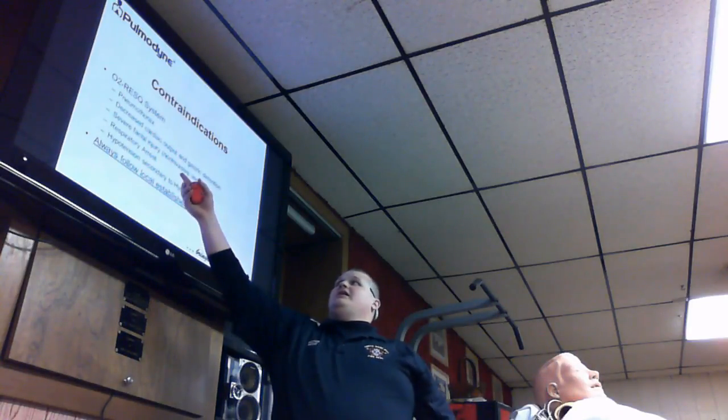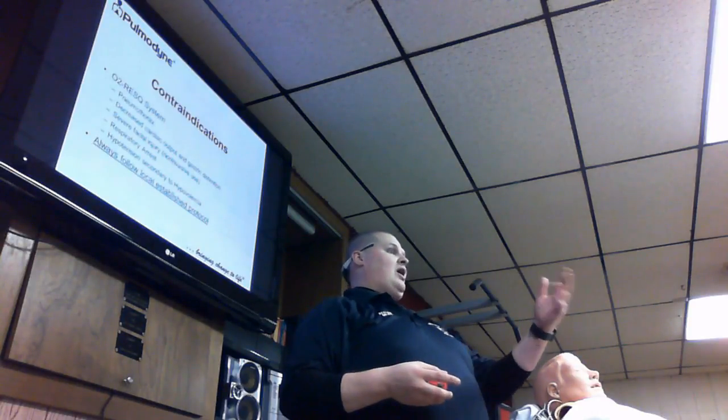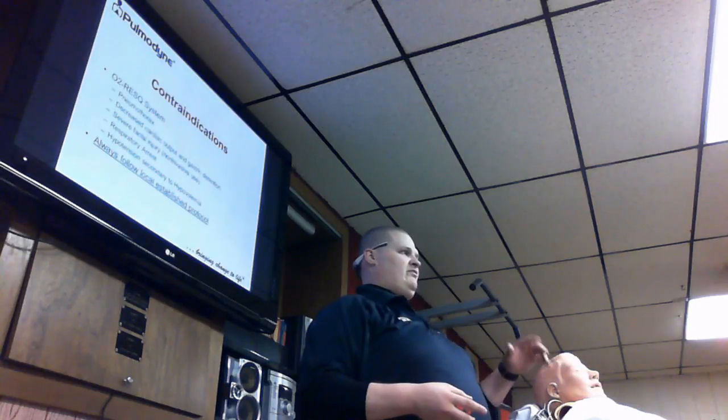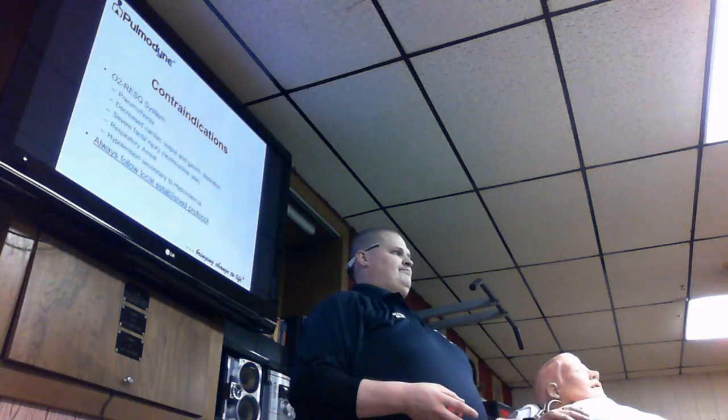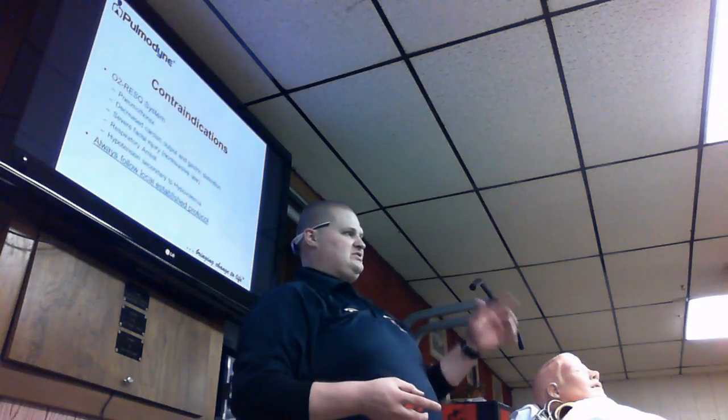Also, anybody who's got any sort of severe facial injury. Does anybody know why I wouldn't be able to put a CPAP on somebody who's got a deformed face, trauma to the face, or anything like that? Not going to get a good seal, or you may have obstructions to begin with. That's right. You're not going to be able to get that good seal.